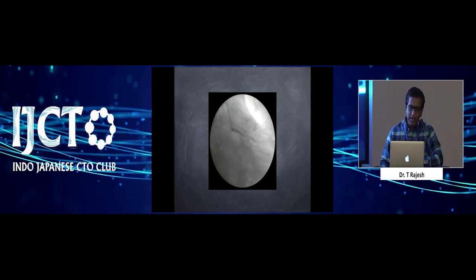This is a young man, a 49-year-old man. He had a history of anterior wall MI some 9 months ago, and he had worsening dyspnea. He had mild LV dysfunction on echo, and MRI had shown viable myocardium in the LAD territory. An angiogram was done to find out what the lesions were and also to achieve recanalization.